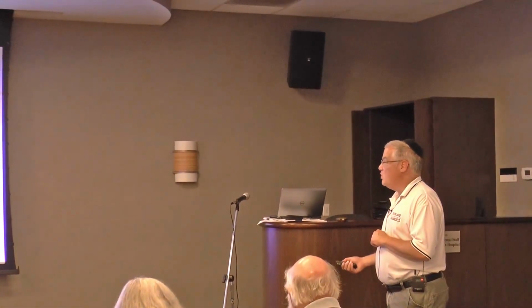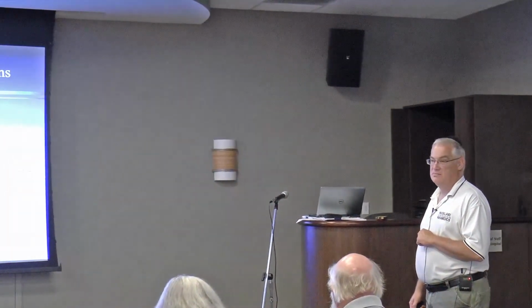Okay, so what's the big thing with this? Why are we going to get calls if somebody has a pacemaker put in? Pacemaker's failing, right? There's some type of problem with the pacemaker. Does it happen very often? No. Okay, but it does happen. A wire could slip. There could be some type of issue. Could be somebody was struck in the chest and the wire got dislodged. So, it could be that just the mechanics of the pacemaker fails.